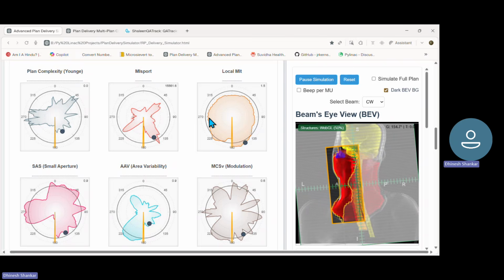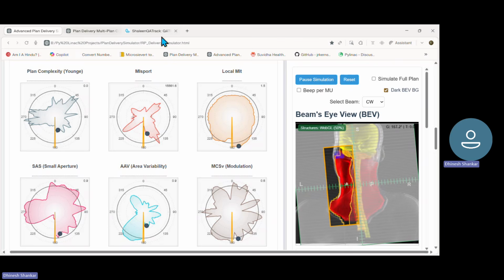As medical physicists, we routinely create multiple treatment plans for a single patient, often 3 to 5 or more. And surprisingly, all of them may look almost identical. Similar dose statistics and comparable dosimetry quality, and they may have clinically acceptable outcomes as well.